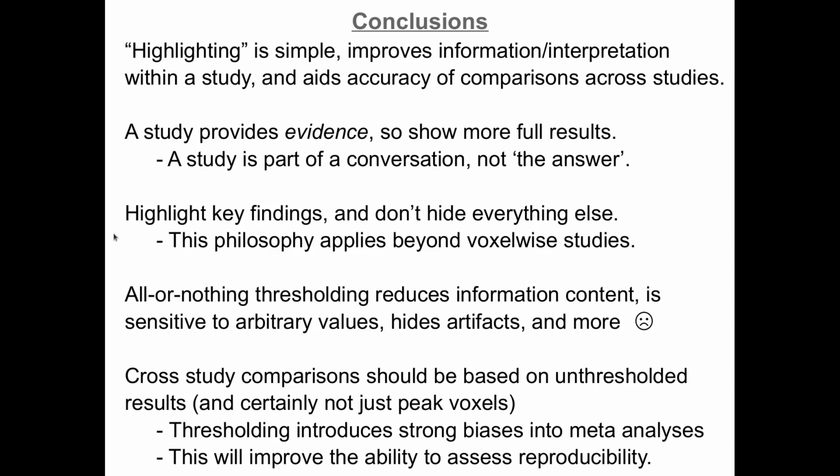And there are lots of ways that you can do this highlighting methodology. We talked about why peak voxel reporting is really, really unstable and is going to set you up for irreproducibility. There are also, in the highlight paper that I showed earlier by Gang Chen et al., other things that apply to this with ROI-based studies, and we've reported on this as well.